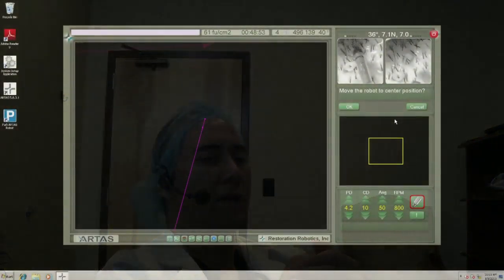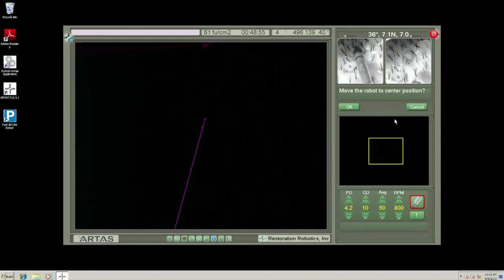It's basically booting the system, making sure that you are inserting your needle for dissection for that day, basically having it run a few systems checks, and you're ready to go. It's basically at that point pointing and clicking on certain buttons on a user interface. There's no entry.